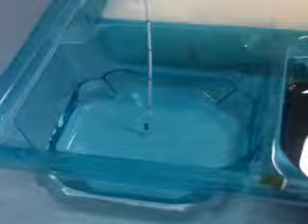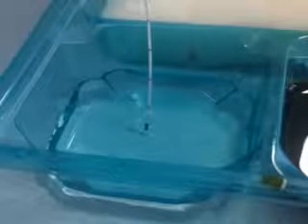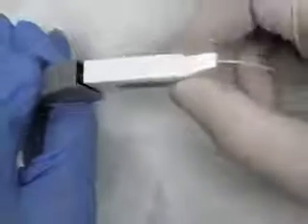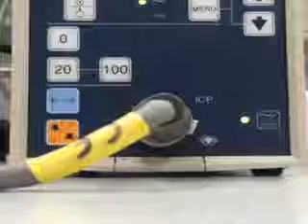Switch on the ICP transducer. Place the ICP sensor in sterile water and ask an assistant to connect the sensor to the transducer. Ask the assistant to calibrate the transducer and record the reference number.